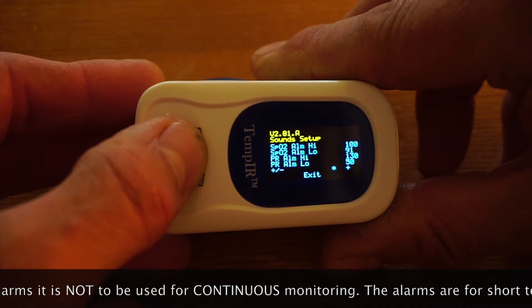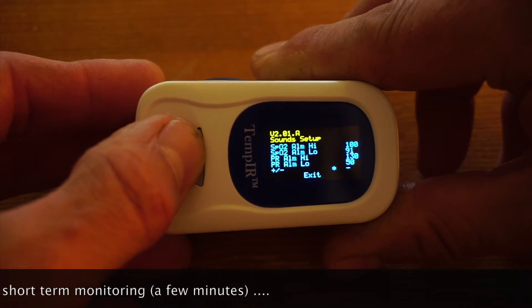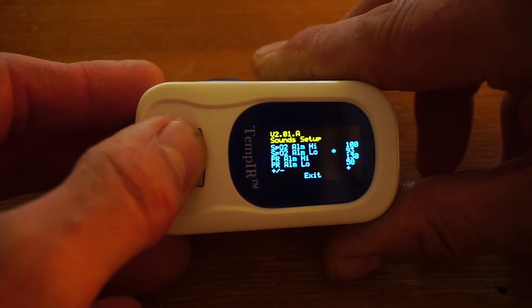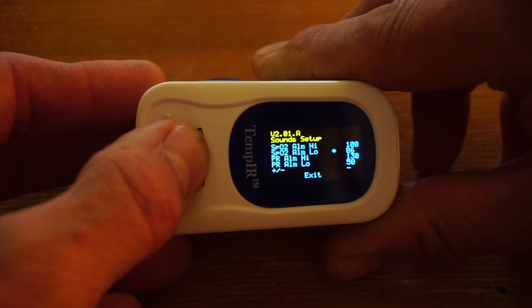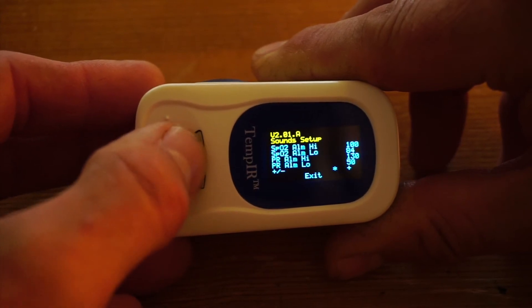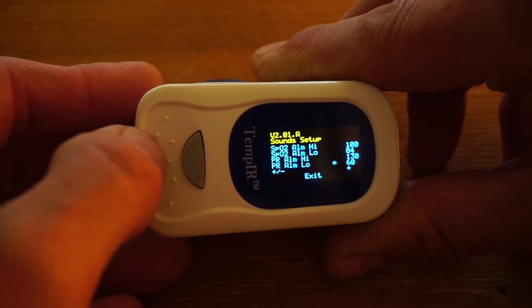The bottom plus or minus determines whether you're going to be increasing or decreasing an alarm parameter. Currently this is set to plus, so if I go to SpO2 alarm low and press and hold it, it will increase it. If I change that to minus and go back to SpO2 and hold it, it will decrease. Here I'm setting an SpO2 alarm of 84 and increasing the pulse rate alarm from 50 to 60.